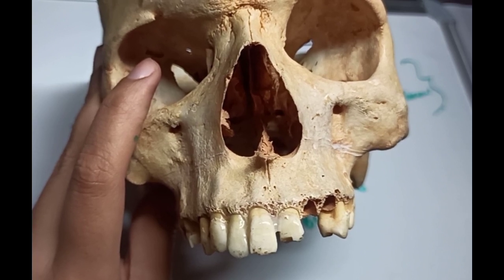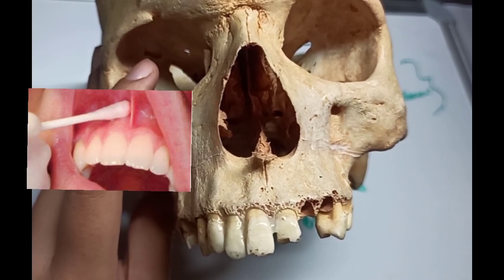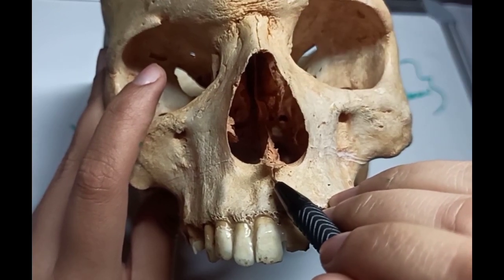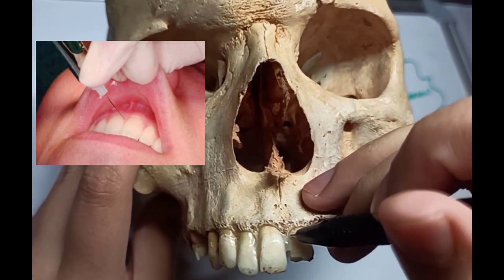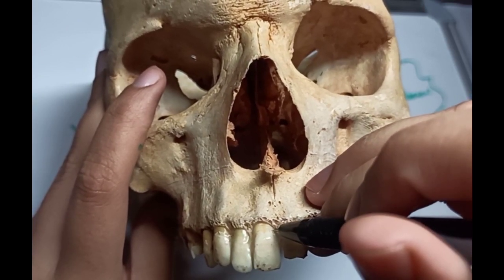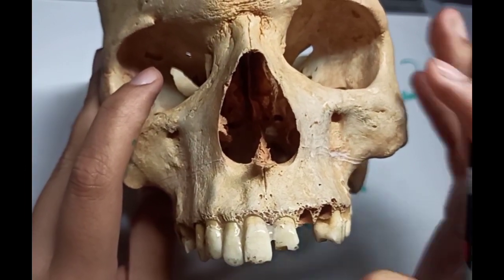Two approaches to this injection are present. The first is the labial approach, which involves 3 needle punctures but, if carried out properly, is significantly less traumatic than the single puncture technique. First, the labial soft tissue between the maxillary central incisors is anesthetized. Then the needle is directed from the labial aspect through the interproximal space between the central incisors towards the incisive papilla on the palate to anesthetize superficial tissues in the area. The third injection is made directly into the now partially anesthetized palatal soft tissues overlying the nasopalatine nerve.